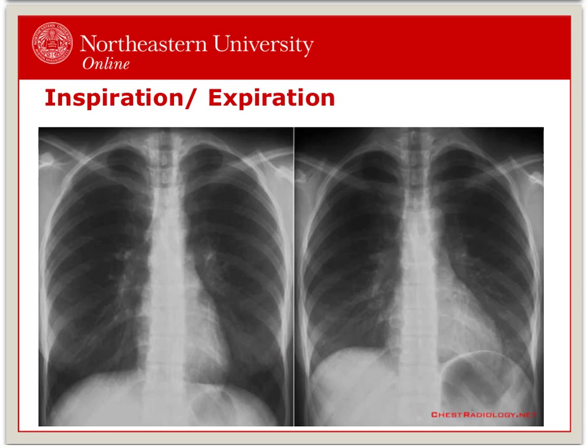An expiration view decreases the volume of the chest, noticed by the dome of the diaphragm. These radiographs are often compared to identify small pneumothorax, foreign bodies, or to identify the movement or lack of movement of the diaphragm.